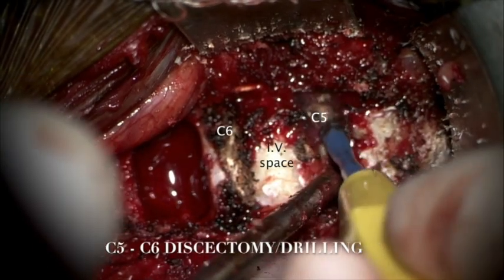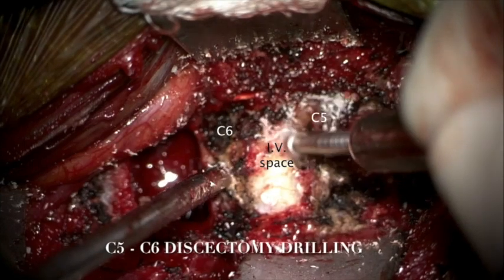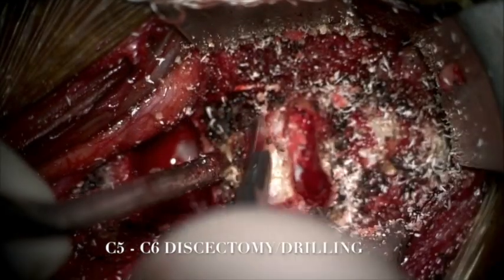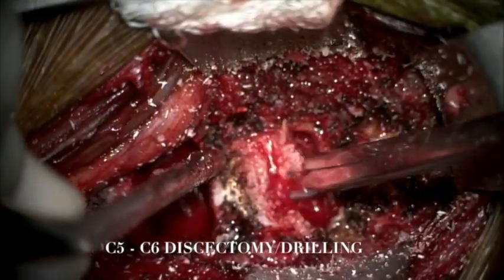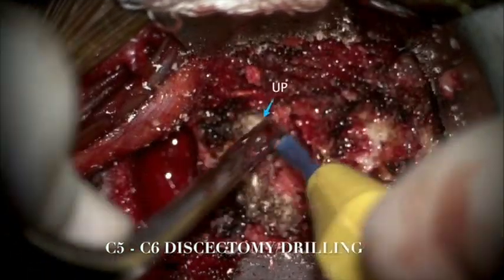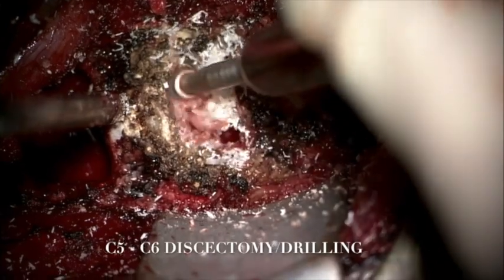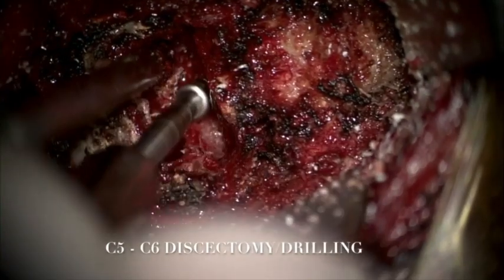The next level was C5-6. We used the Midas-Rex drill with an M8 tip to shave off the inferior lip of the C5 vertebral body. We then used a number 15 blade to incise the anterior longitudinal ligament and emptied the disc material with pituitary rongeurs. We exposed the medial aspect of the uncinate processes and again used the Midas-Rex drill with the M8 tip to shave off the cartilaginous endplates of C5 and C6 vertebral bodies and thin down the disc osteophytes inferiorly.